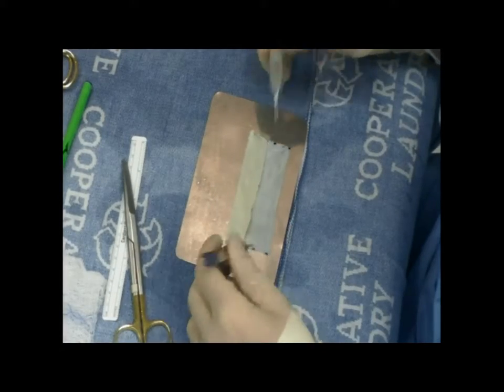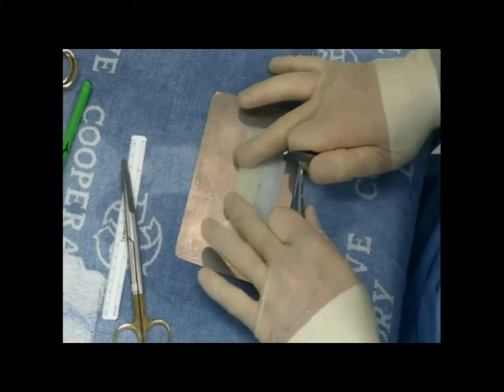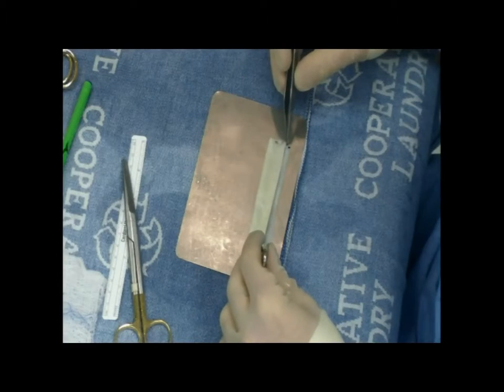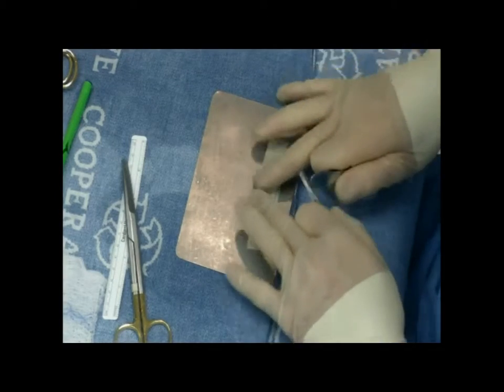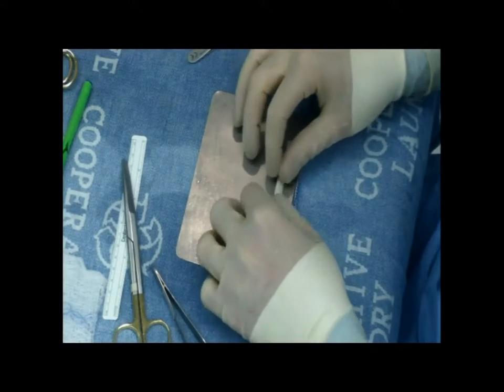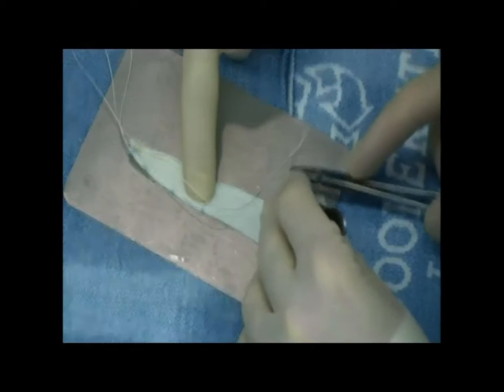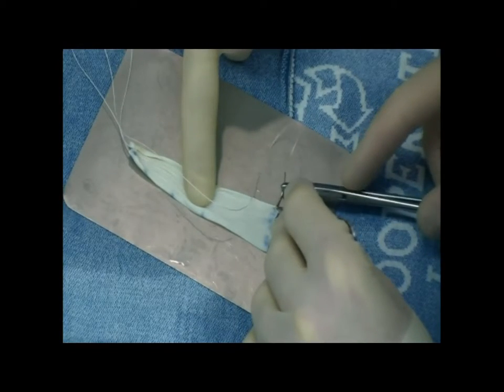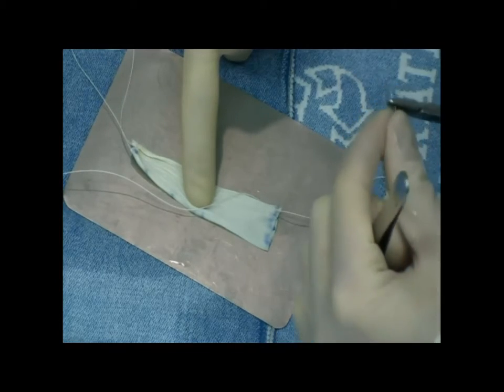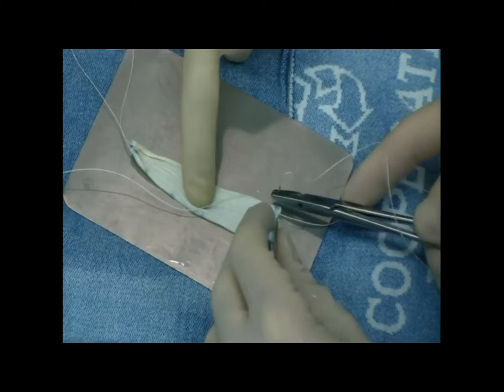At this point, I'm rolling the graft in thirds to try and determine what my final shape is going to be before we do the compressive running stitch. I folded it into thirds and now I'm rolling the graft to see if it's uniform all the way across and the right size. Once I'm happy with that — and it usually compresses by about a millimeter or two — I basically put accordion stitches on either side of the graft to begin the process of making it into a cylinder.